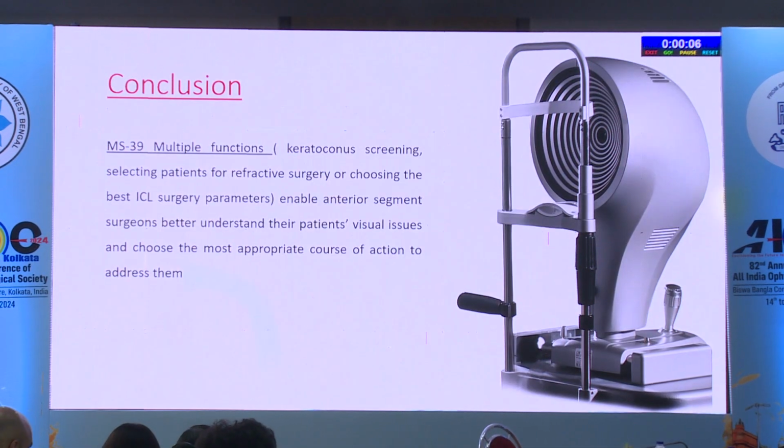So in conclusion, MS39 has multiple useful functions for a refractive surgeon to enable an anterior segment surgeon to better understand their patient's visual needs and requirements and choose the most appropriate course of action to address them.